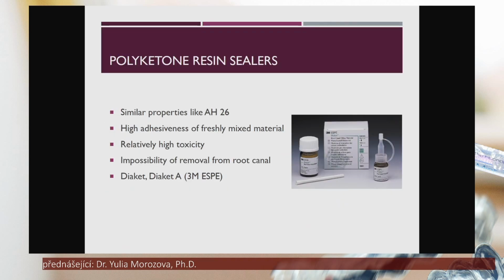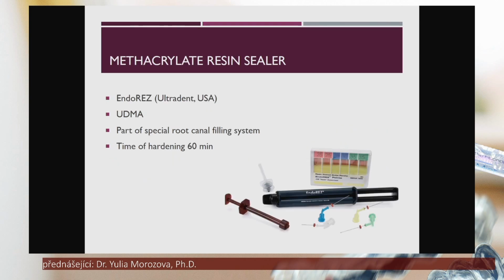Polyketone resin sealers have similar properties like epoxide resin-based sealers. They have high adhesiveness of freshly mixed material. They have relatively high toxicity, and also it's really complicated, almost impossible to remove from the root canal. As a representative, we can say, for example, Diaket sealer.